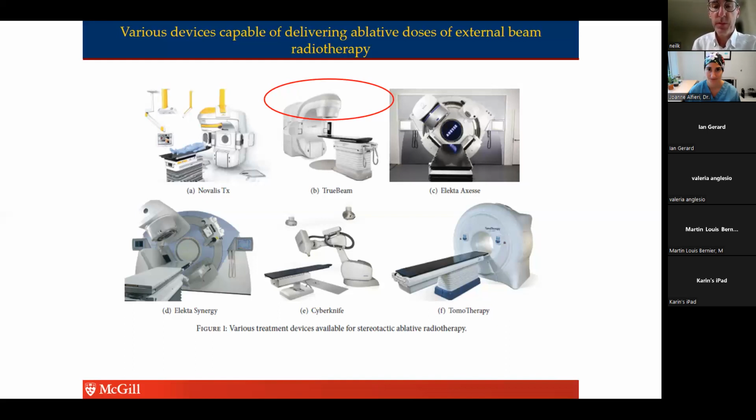And what is that? More specifically, we're talking about the use of X-rays. High energy X-rays that are emitted from the head of the machine. The patient is lying on a table and the head of the accelerator rotates around the body of the patient with the X-rays being emitted from the head directed towards the target, with the tumor generally within the patient. But in this context, we're talking about a non-cancerous target, a lesion, a scar, a substrate within the scar of the heart.